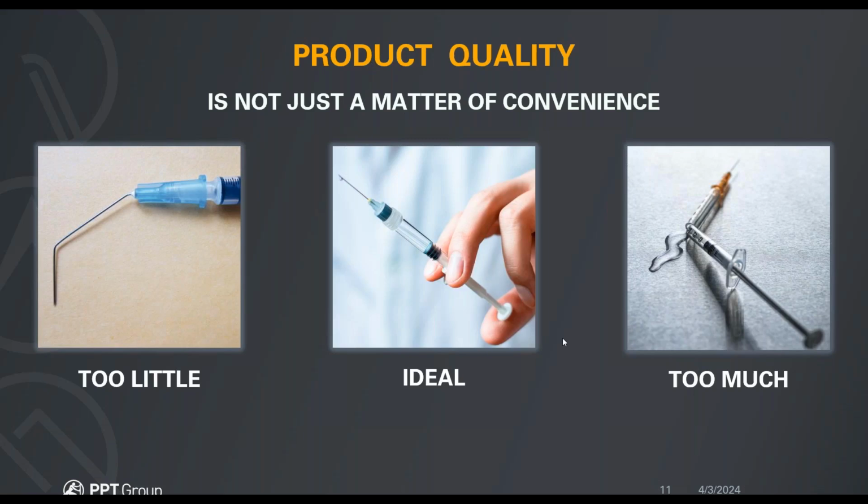So you don't want dull needles out there, because the key is to be able to inject a patient with as little pain as possible. I know that's always my personal preference, as quickly and as painlessly as possible. I don't even want to know the needle was ever there. So these are some of the factors that surround the process of coming by that value that you consider ideal, as far as an ideal sharpness value, an ideal break loose value, an ideal glide value.